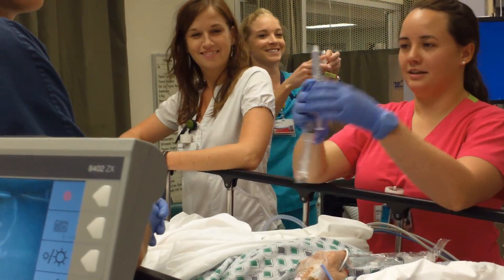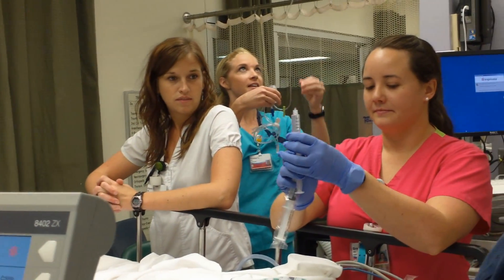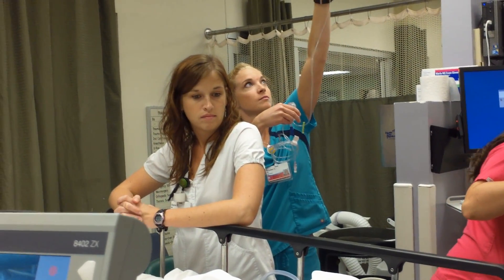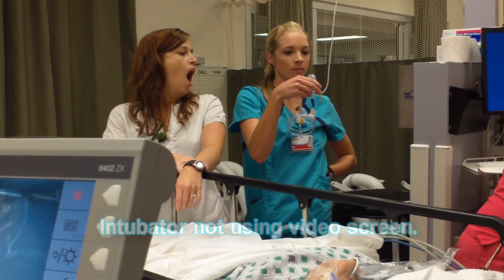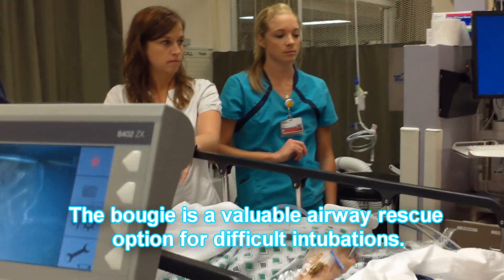So what we're going to do is go ahead and do the intubation with the Storz. However, the intubator is not going to be able to visualize it — we're going to watch the screen. He's going to use the bougie, so we're going to watch him do a bougie intubation.